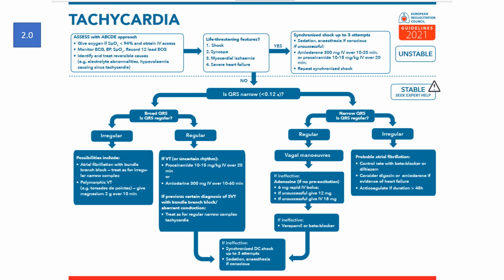And maybe we should dive in more to these criteria. 90% specificity on SVT versus VT is maybe all right if we can stop converting some of the patients that we want to anticoagulate first, right? So, yeah, it's a hard discussion, right?